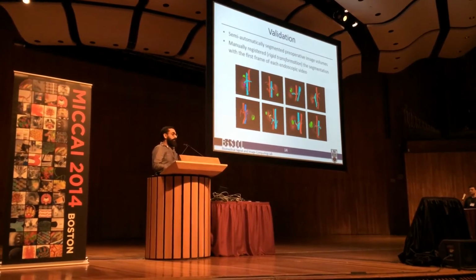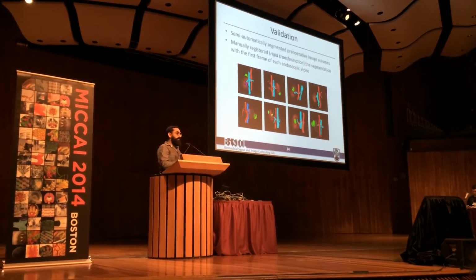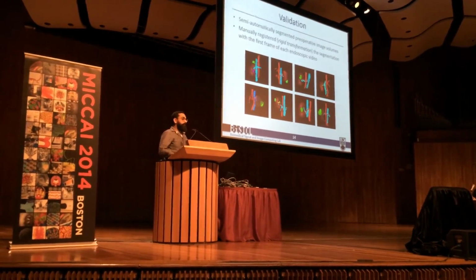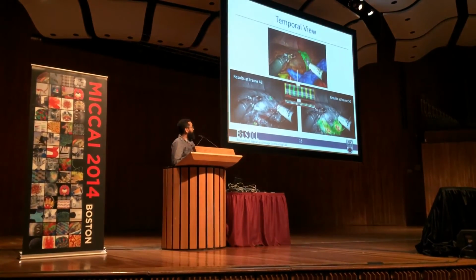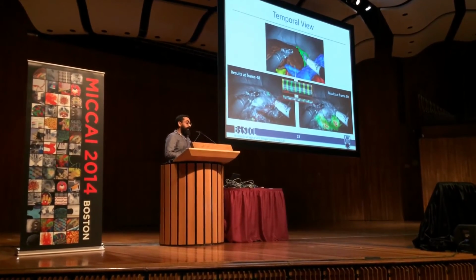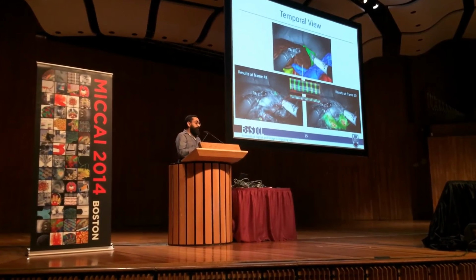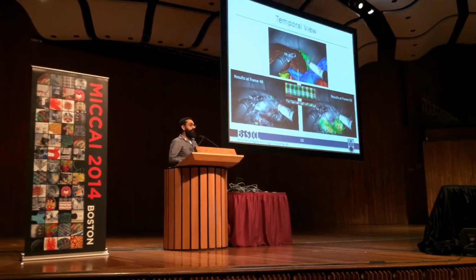We use these other organs, including the spleen, the liver, and the ribs, to manually align these segmentations onto the first frame of the endoscopic video. And this essentially generated a ground truth against which we could evaluate our localization of the vessels, as you can see here. So the very first interesting observation that we made is that we had enough temporal resolution to differentiate between arteries and veins. In this particular example, the arterial pulsation occurred 2 frames before the venous pulsation.